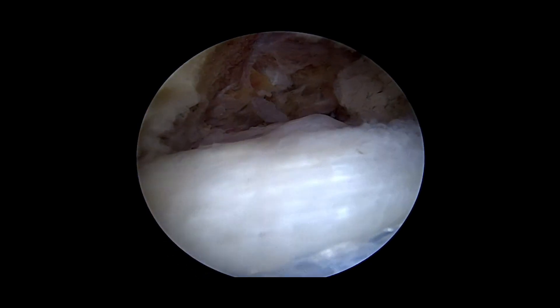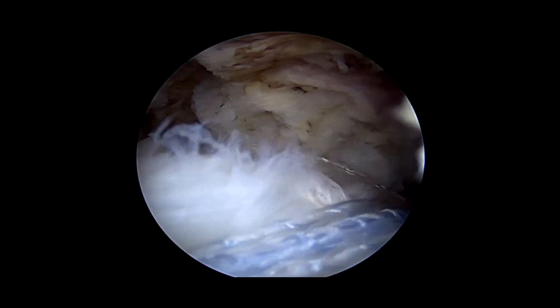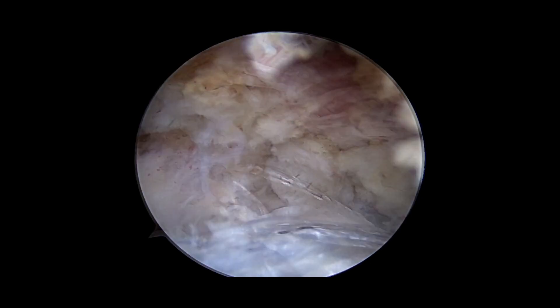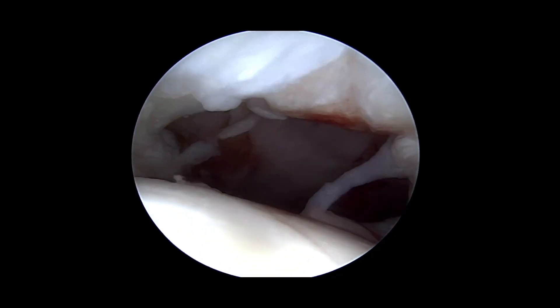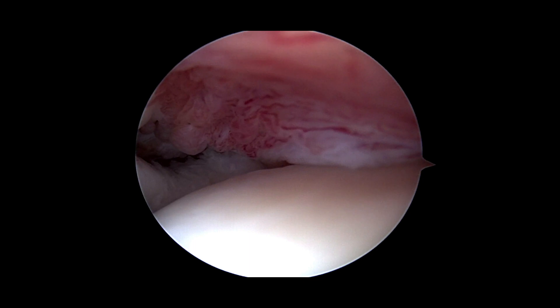At the end of the procedure, we can see we've got a nice tensionless repair. The footprint is nicely covered by the tendon. There's plenty of space underneath the acromion. Viewing from within the joint, this was the original tear, and this is after it's been repaired.